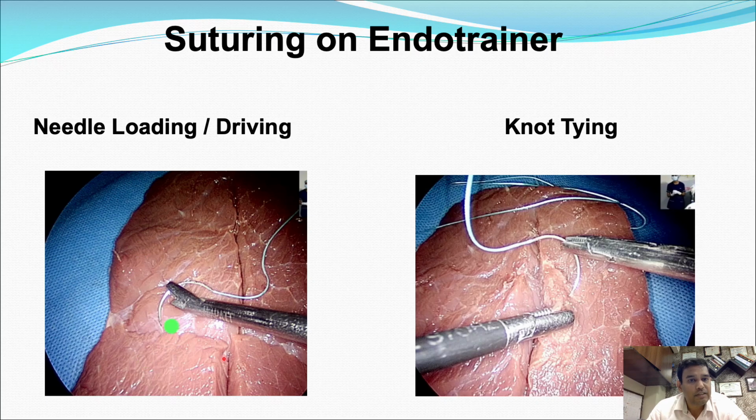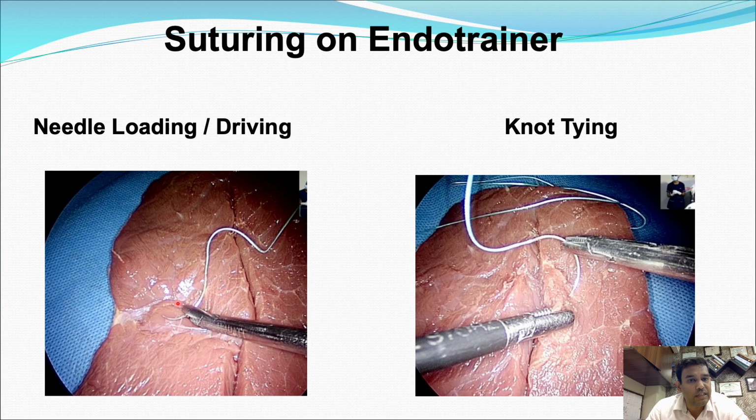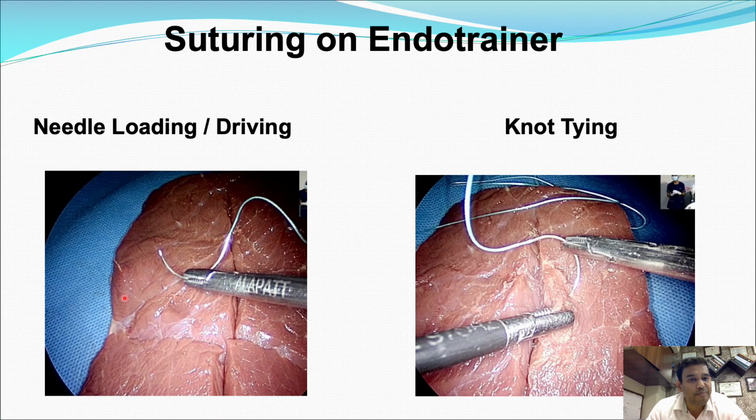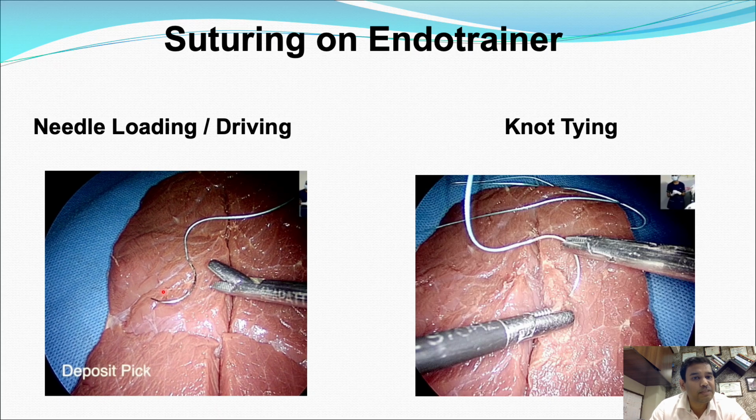You can see here, this is called the crying position of the needle. You take the needle. This is the fixed end. This is the mobile end of the needle holder. You keep it near the needle and then you press over the tissue. Press over the tissue and then the needle automatically rotates and gets in position. It forms a right angle with the needle holder. This is the smiling position of the needle.